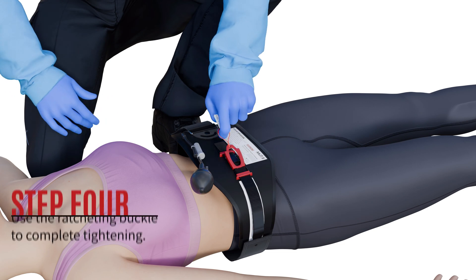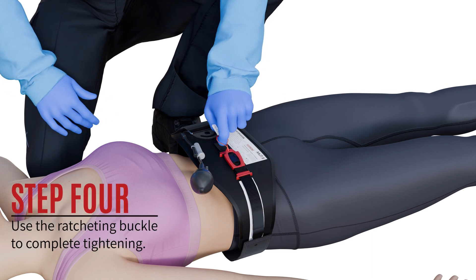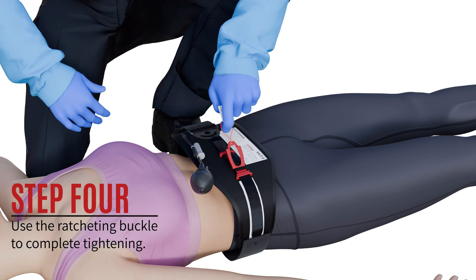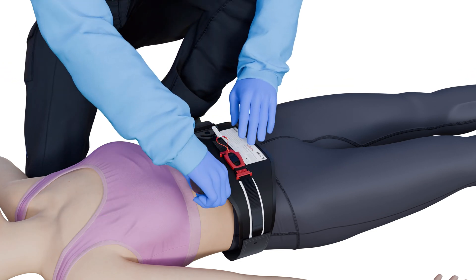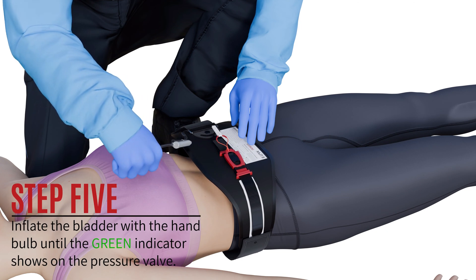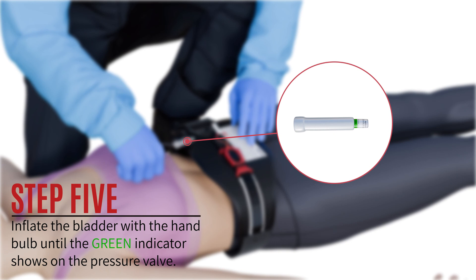Step 4: Using the ratcheting buckle, pull up on the red tab 3 to 5 times to continue tightening. You will hear clicking. Step 5: Inflate the bladder using the hand bulb until the green zone appears on the pressure gauge. Optimal range is 250 to 300 mmHg of pressure.